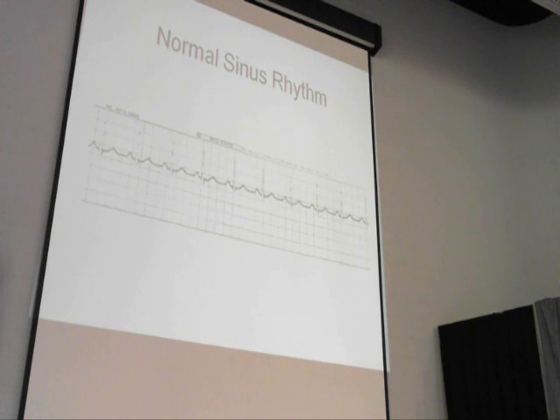Everything is set in stone, the conduction system, the normal pathway, and everything has a specific time frame to get this job done. The top of the heart, starting at the SA node, has a time frame for the impulse starting and passing on, and then the ventricles have a time frame, then there's nothing. Normal PR interval is 0.12 to 0.20 seconds.